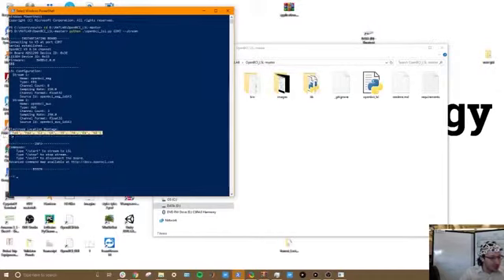So you can see that these are the different electrode locations we have connected. You have to make sure that they're connected in the correct order. The order that you see them showing up on the screen here is actually the same order that they're connected along the board from left to right. So if you're looking down on the board with the pins facing this way, 1, 2, 3, 4, 5, all the way out to 8, you have to connect those in that order so that they show up correctly in the GUI as well as stream correctly through LSL.